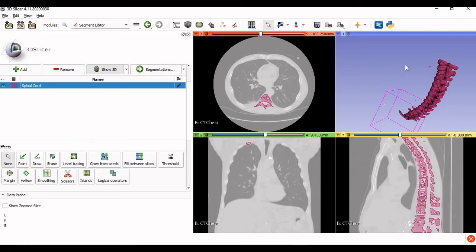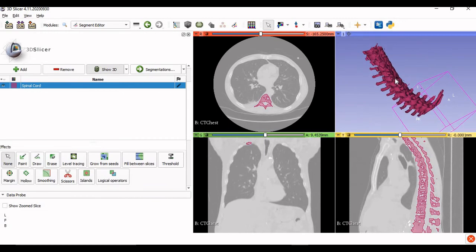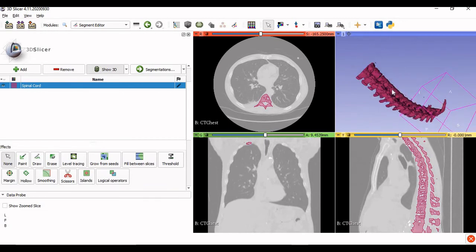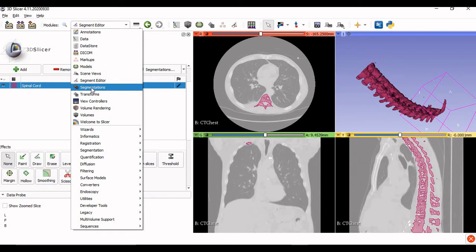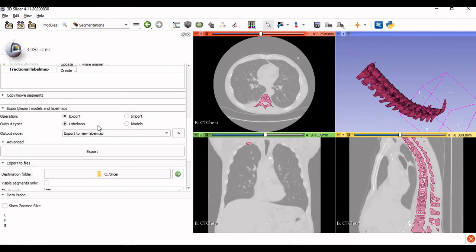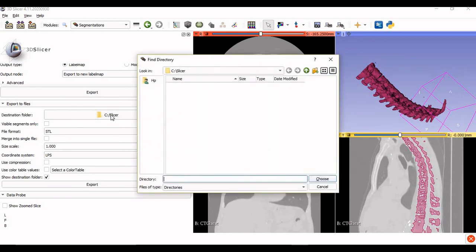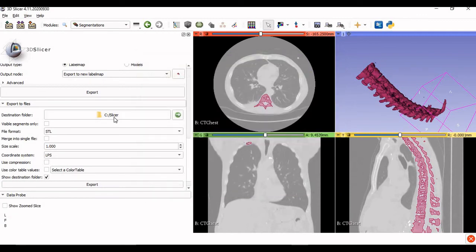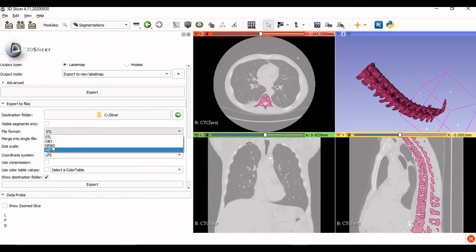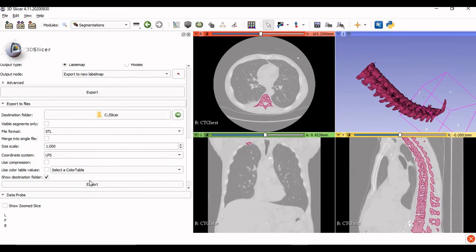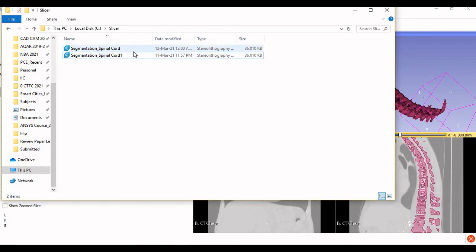Once you are satisfied with the generated model, the next task is to save it in a compatible file format so you can open it in the required software. I will show you how to save it as a .stl file. Go back to the dropdown menu and below Segment Editor you will find 'Segmentation.' Click on it, scroll down, and you will find a tab labeled 'Export to Files.' Here you can select the required folder — I have selected a folder called 'slicer' in my C drive. Select STL as the file format, then click 'Export.' You can then see the file has been generated in the selected folder.